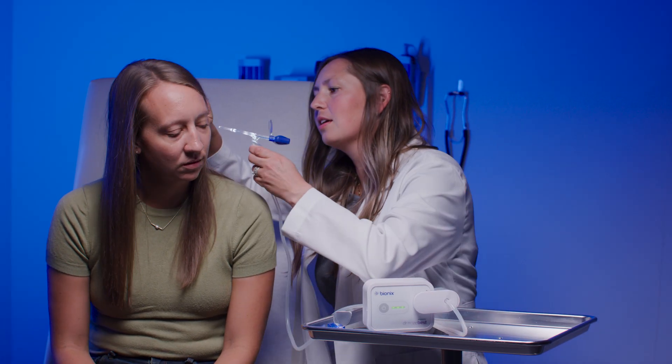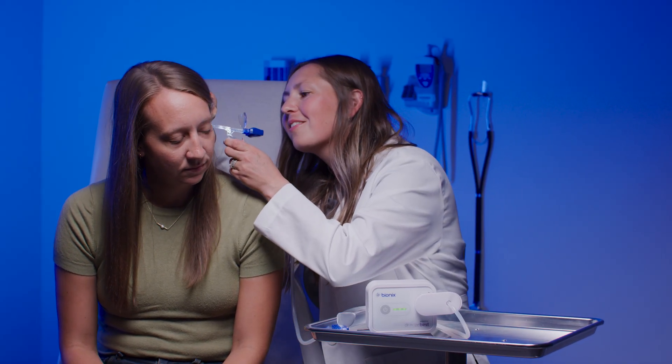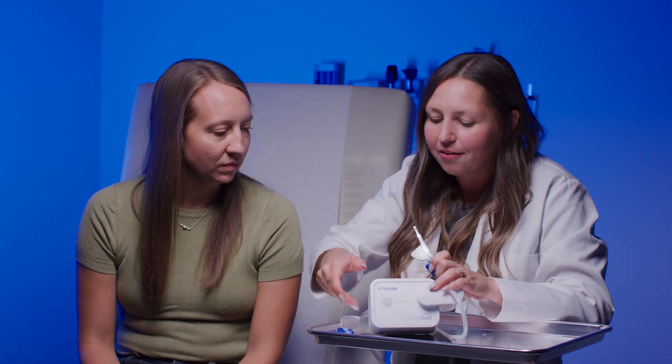Use low for light removal, medium for routine extractions, or high for deep or firm debris. As you select the suction level, you'll notice the difference.